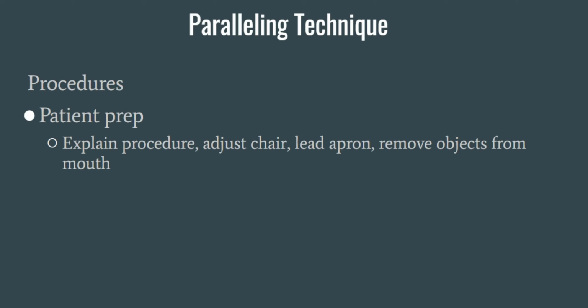So you want to explain the procedure so that they understand what is happening. Why are we doing this? What is the purpose of this? Do we need to do this? Remember, there's going to be lots and lots of questions from certain patients. Adjust the chair.